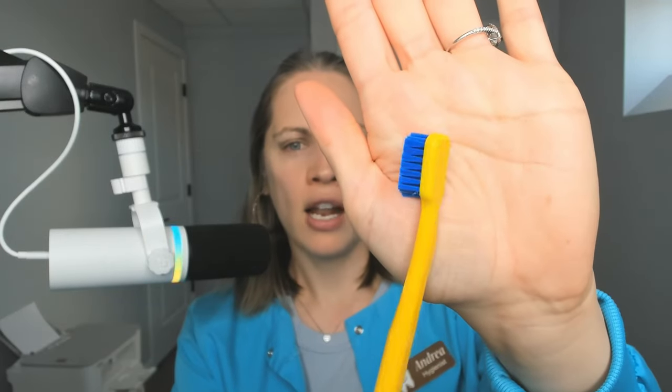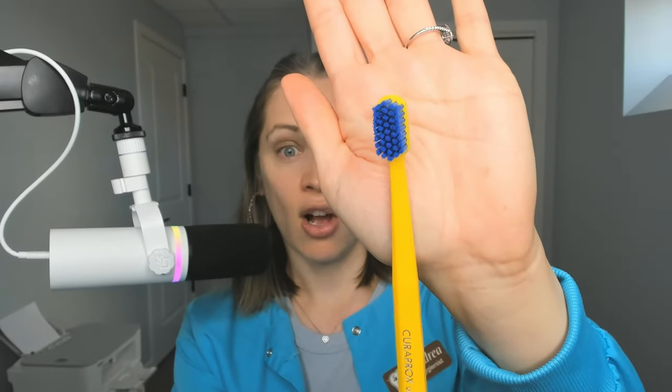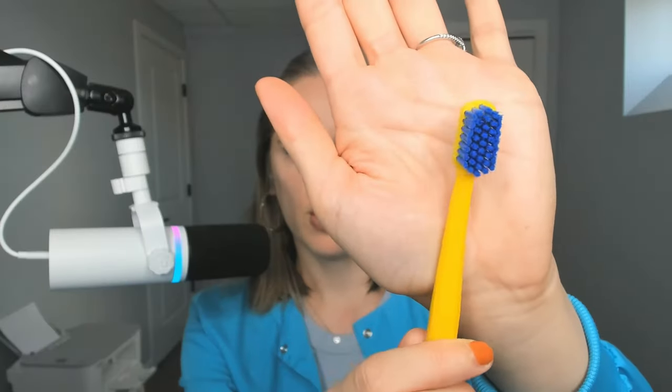I'm going to open this up and show you. Notice how there are a lot of bristles — they're very soft, actually ultra-soft. If you're brushing with a medium or hard brush, you have to push harder to get the bristles to splay against the tooth. The harder you brush, the harder you push — that's not good. These basically do the hard work for you so you don't have to apply a lot of pressure, and that's the way to go.